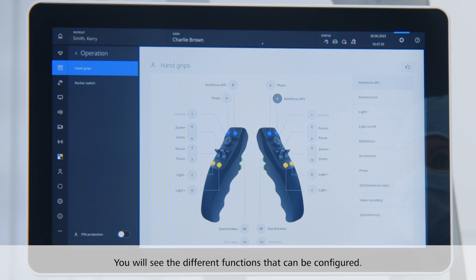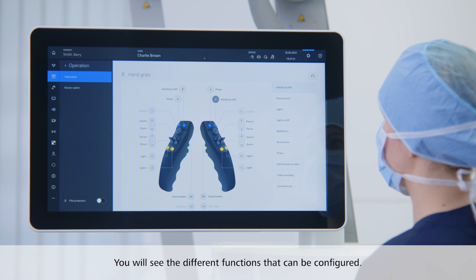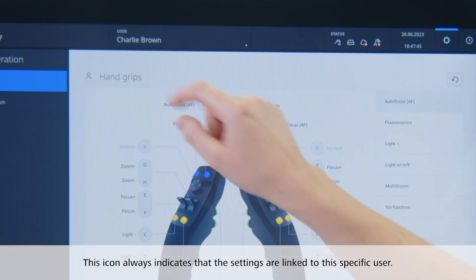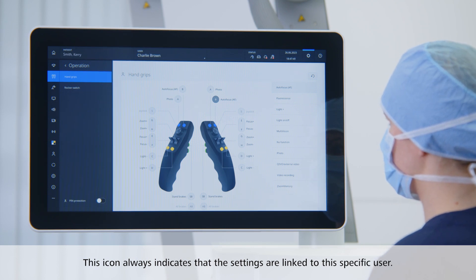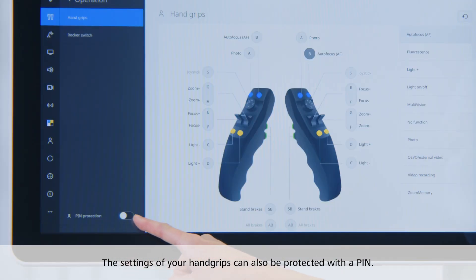On the right side, you will see the different functions that can be configured by clicking on a specific button. This little icon always indicates that the settings are linked to this specific user. You will find this icon throughout the whole system for different settings. The settings of your hand grips can also be protected with a pin.